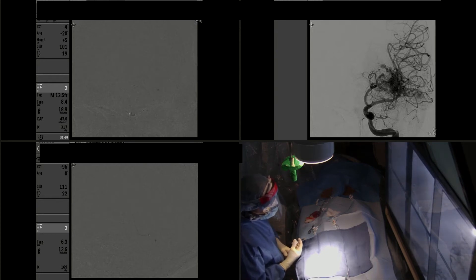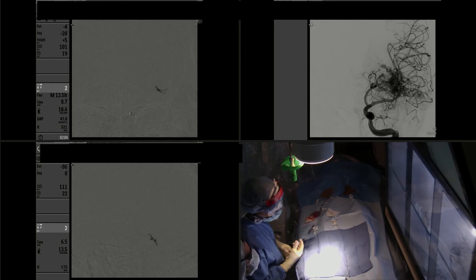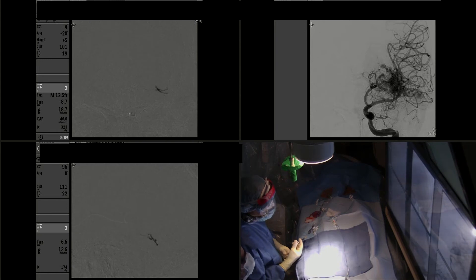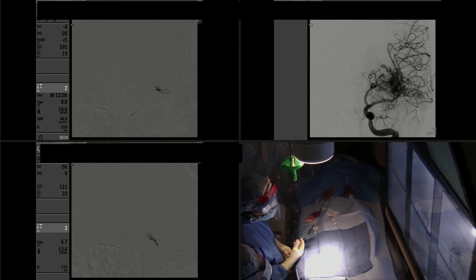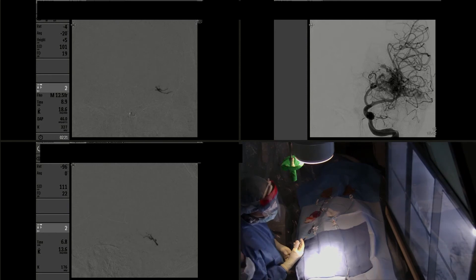We decided it was a safe position for endovascular embolization, and you can see the injection of Onyx. We started by injecting one milliliter of lidocaine, or 20 milligrams, followed by a total of 0.25 milliliters of DMSO for the dead space of the microcatheter, and then followed that with the injection of Onyx. We ended up injecting a total of 1.8 milliliters of Onyx.